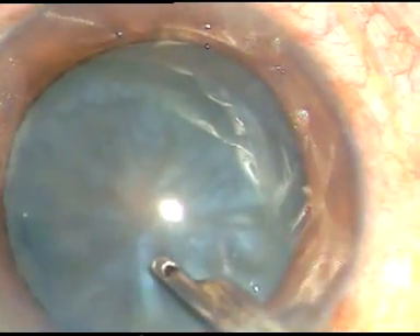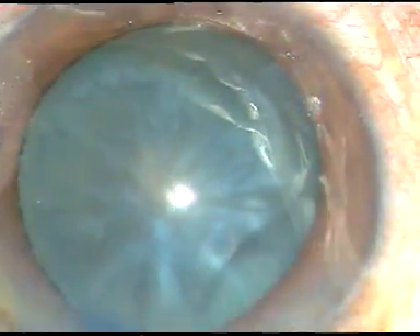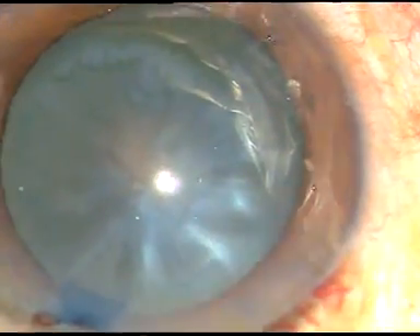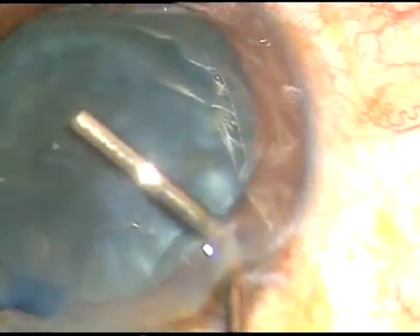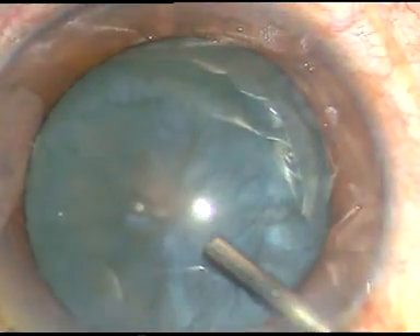That's it. Now, viscoelastic substance is used to fill the anterior chamber. Here it is — this is hydroxypropylmethylcellulose.